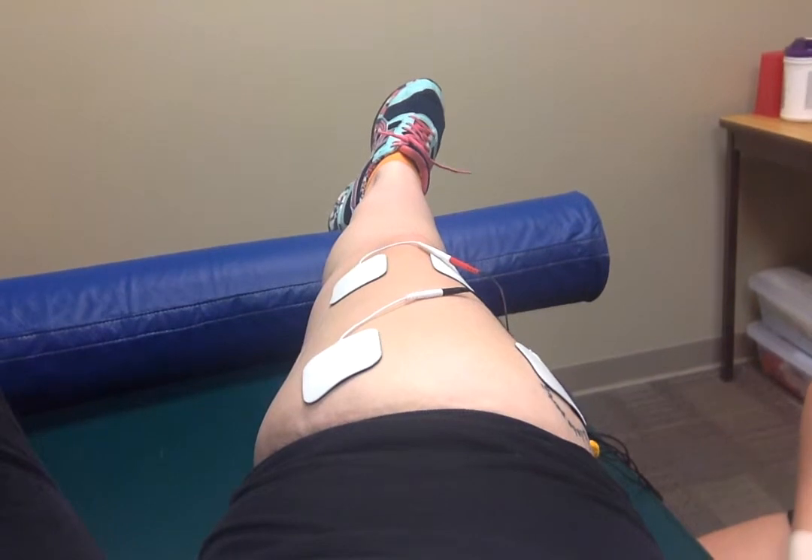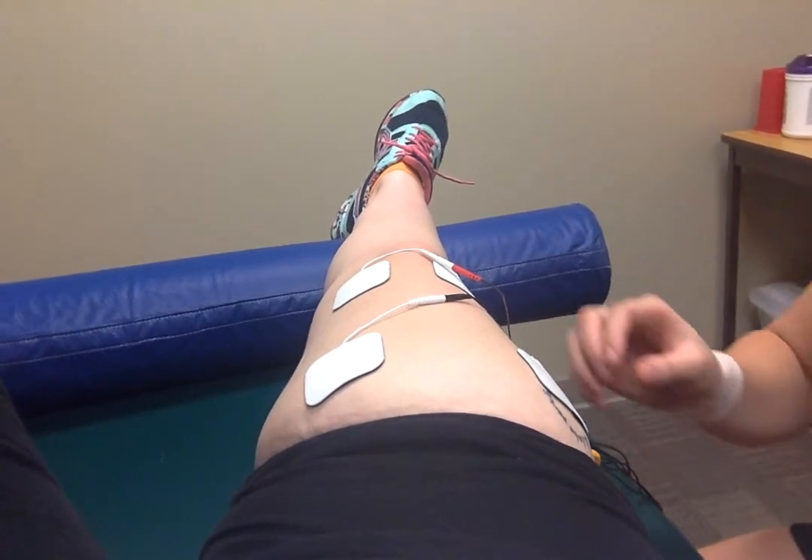This is definitely something we'd use — both in the pre-op phase before surgery, and we could also use it pretty much immediately when they come in for post-op as well.